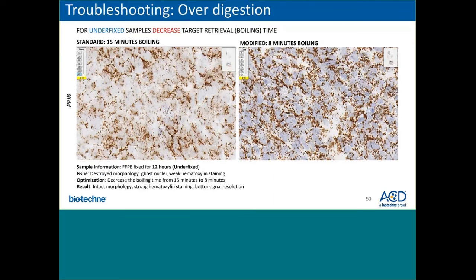Here we're looking at the same tissue section, but also stained with the PPIB. So on the left hand, you'll see the standard 15-minute boil, as opposed to the right, which is the modified 8-minute boil. Again, we're looking at better intact morphology, a stronger hematoxylin staining, and there's even better signal resolution.